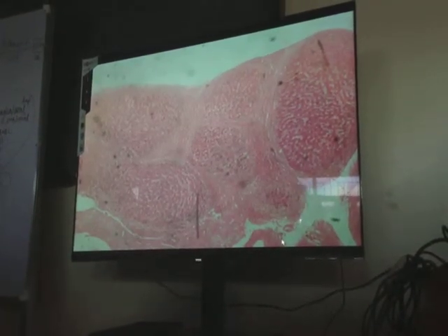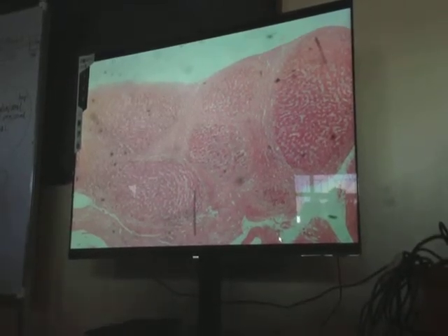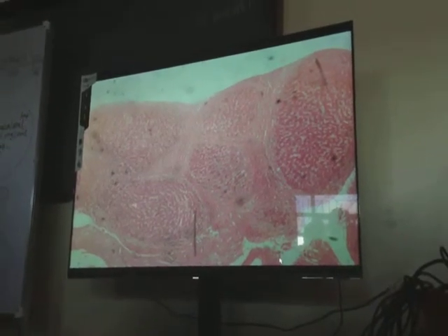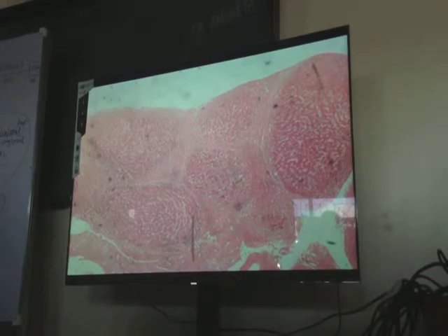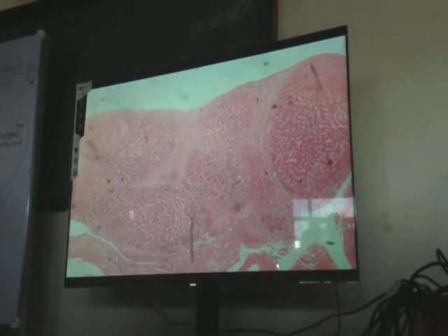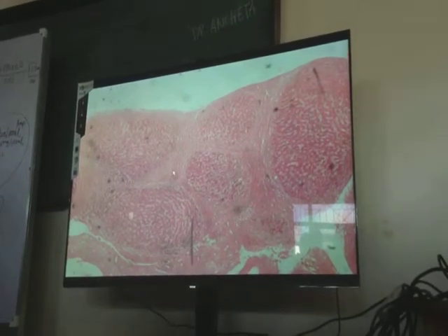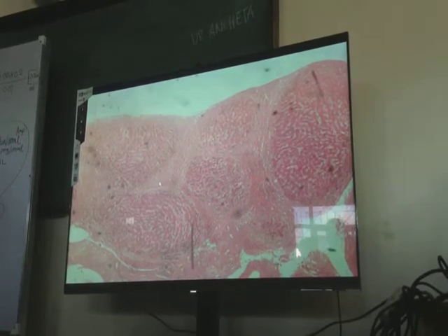You had the lecture on the pathology of the liver already. On that magnification, what should be our diagnosis? What are the prominent features that you are able to identify? Again, number one, fibrosis. And then notice that the fibrosis in this slide is already extensive.